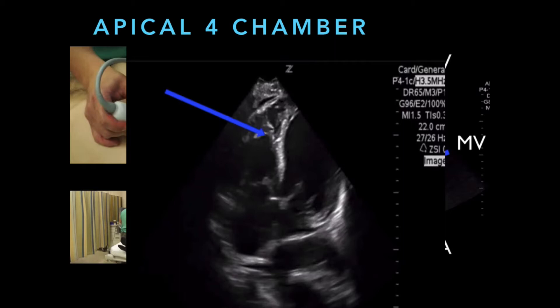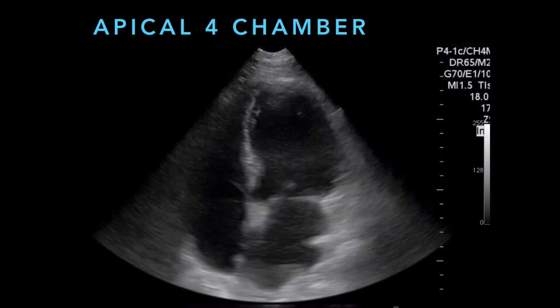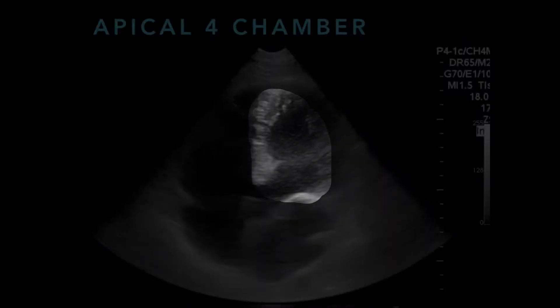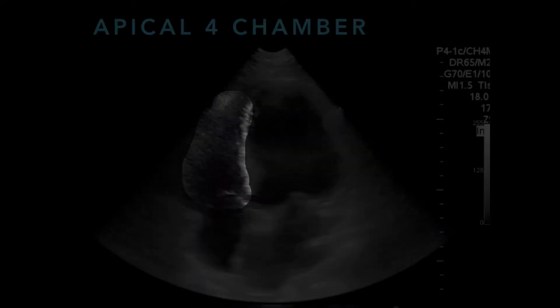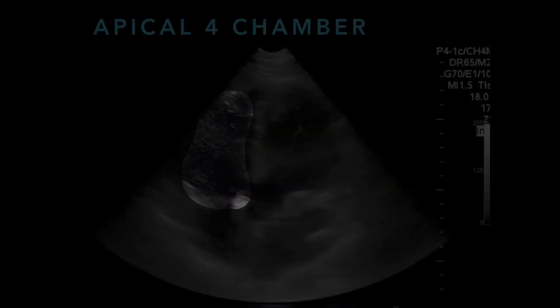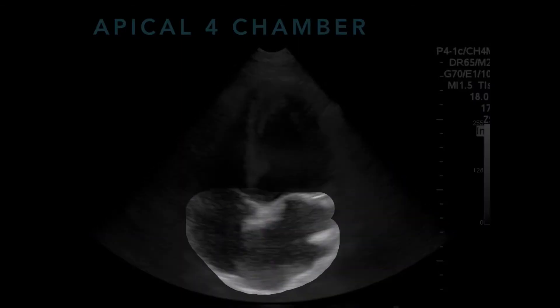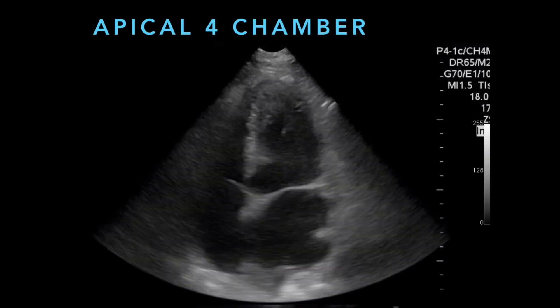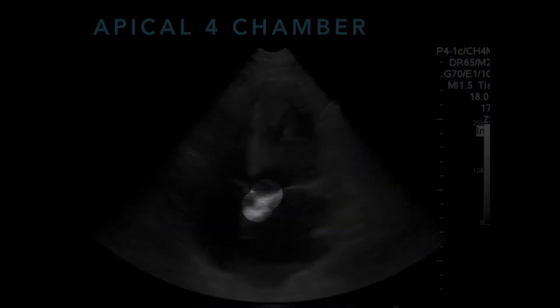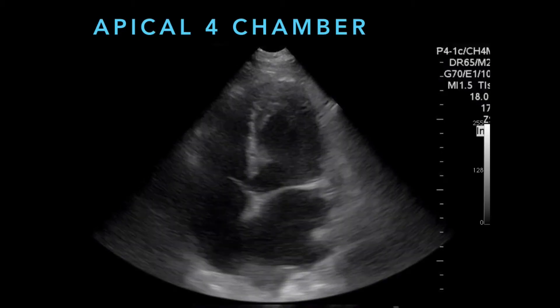In a normal heart, the left ventricle should be more muscular as well. Here's a nice normal apical four-chamber. Left ventricle is on the right side of the image, right ventricle is on the left side of the image, and you can see the left ventricle is much larger than the right ventricle. You can see the atria side by side, mitral and tricuspid valves, and a little bit of the aortic valve in the middle below the interventricular septum coming off the left ventricle.